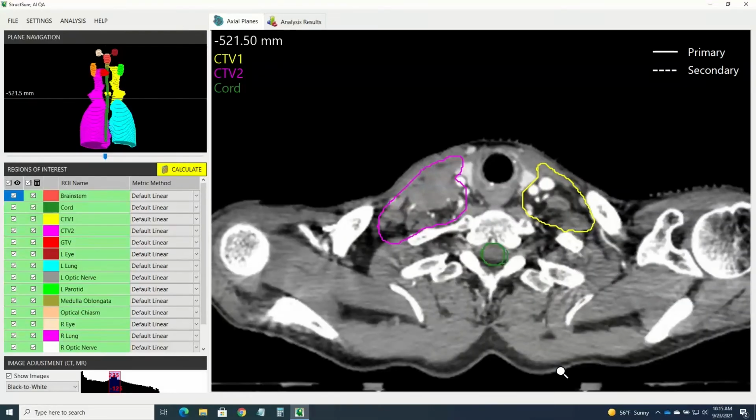We load it up, and now we have our interface right here. In the upper left, we have this navigation plane, so we can see it from, let's say, the 10,000 foot level. We can see all the areas that this set includes. Down below are the regions of interest that were found common between the two sets. Okay, there that is.